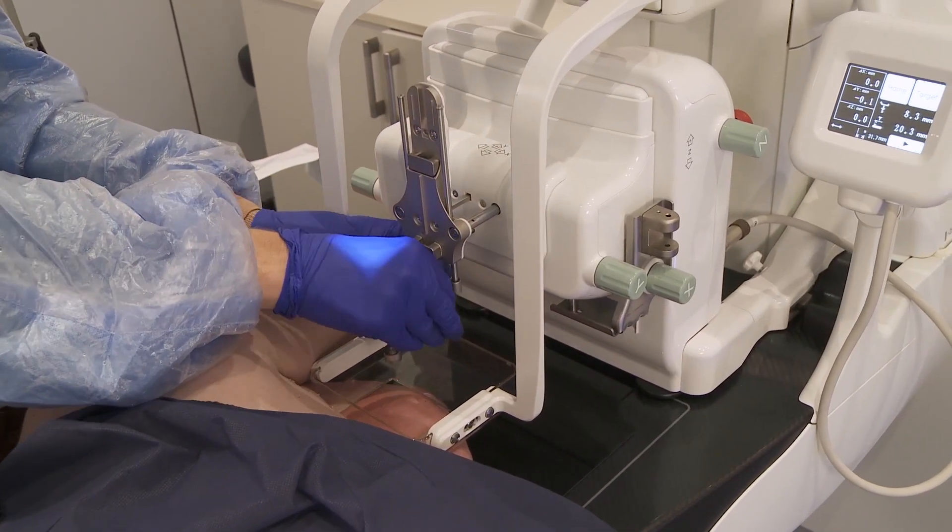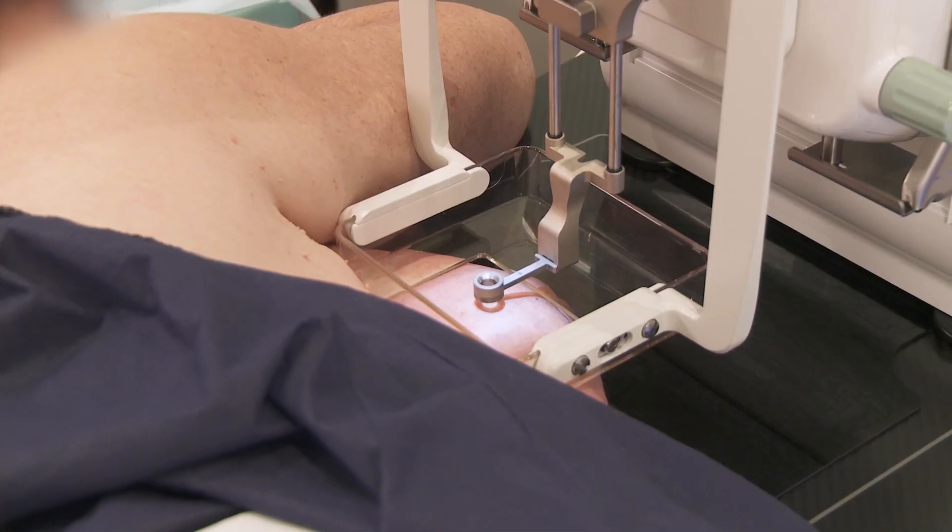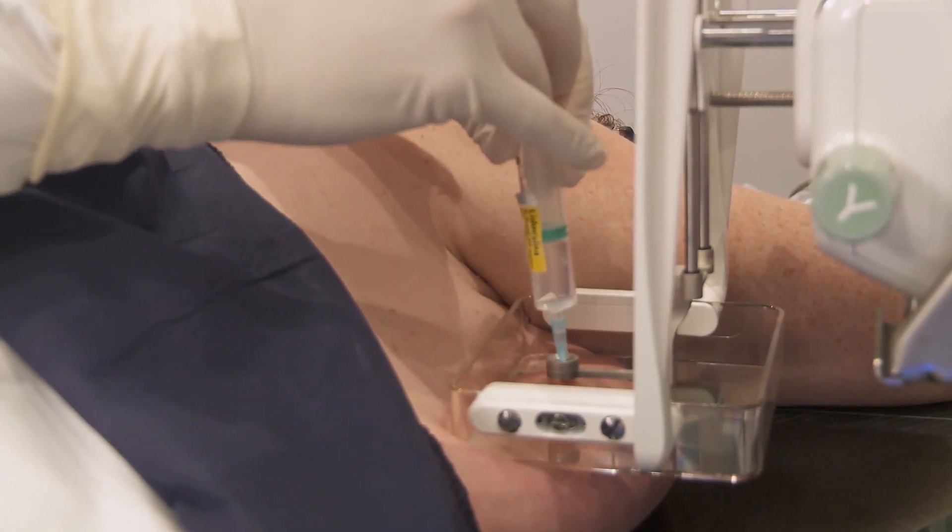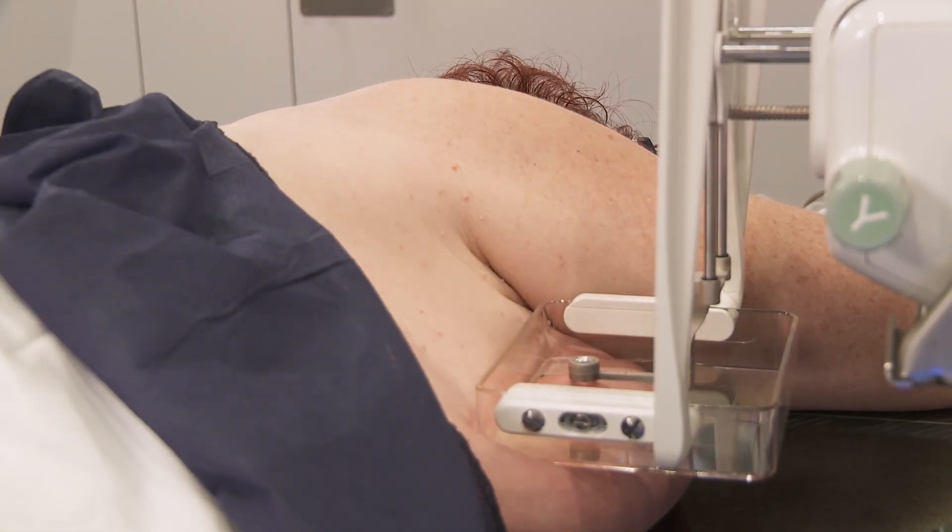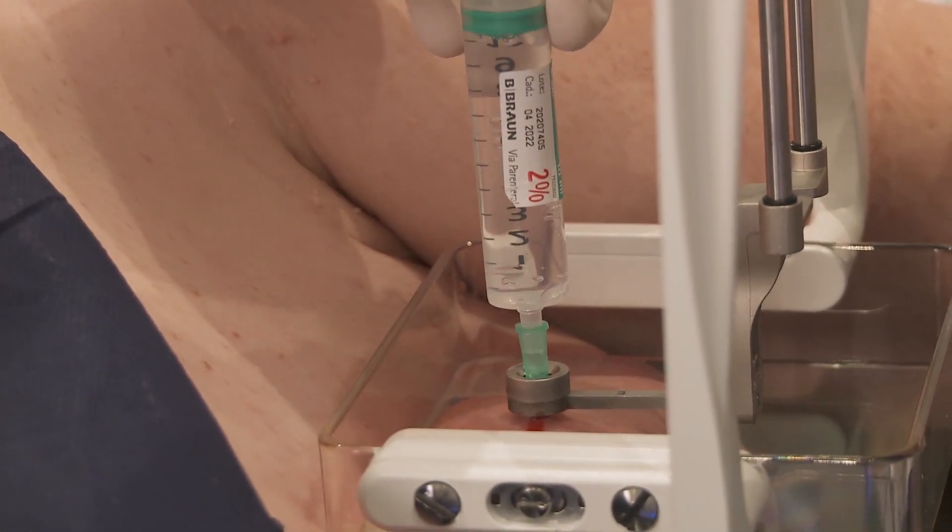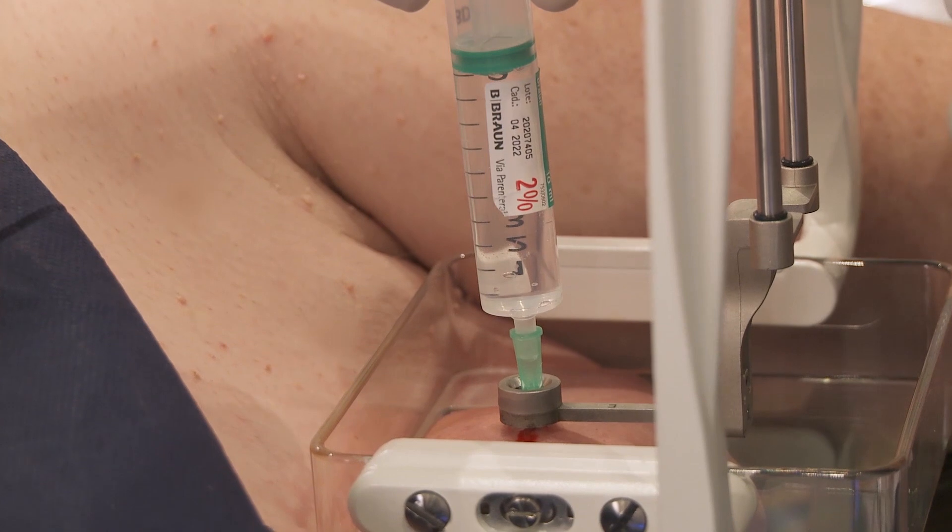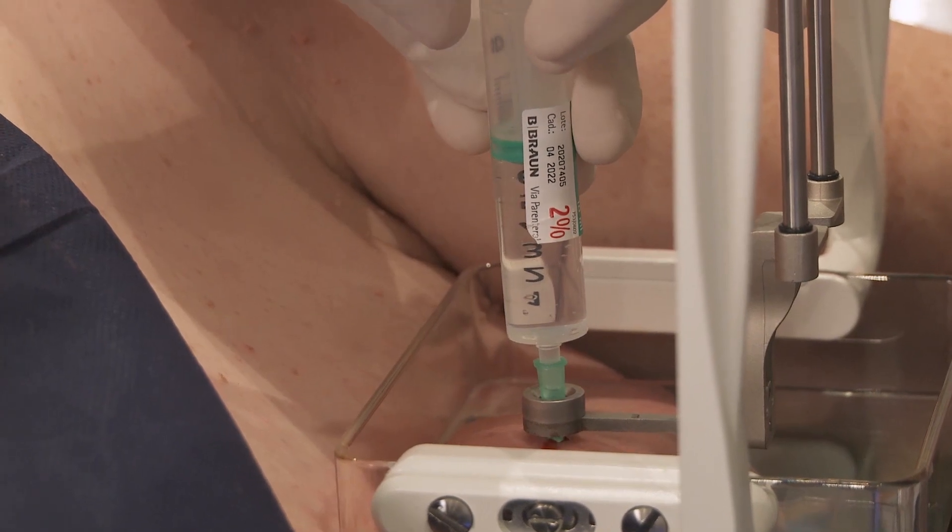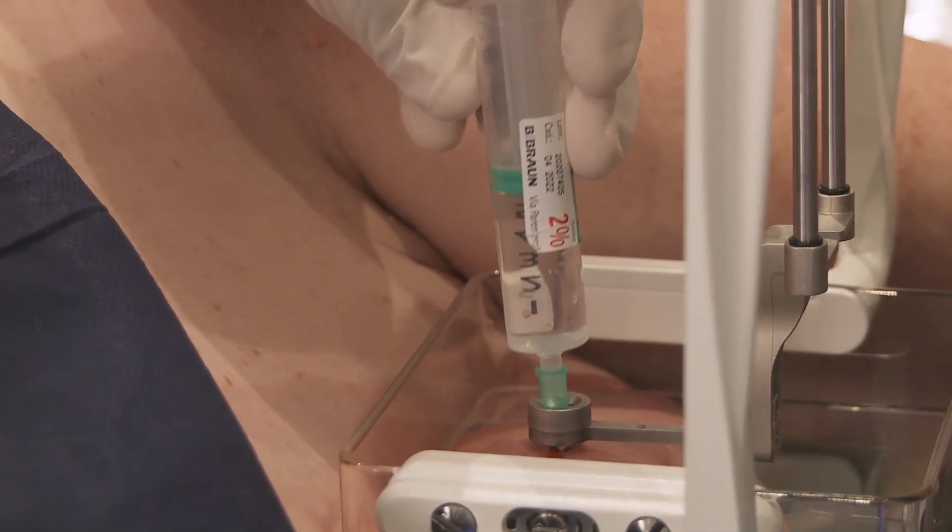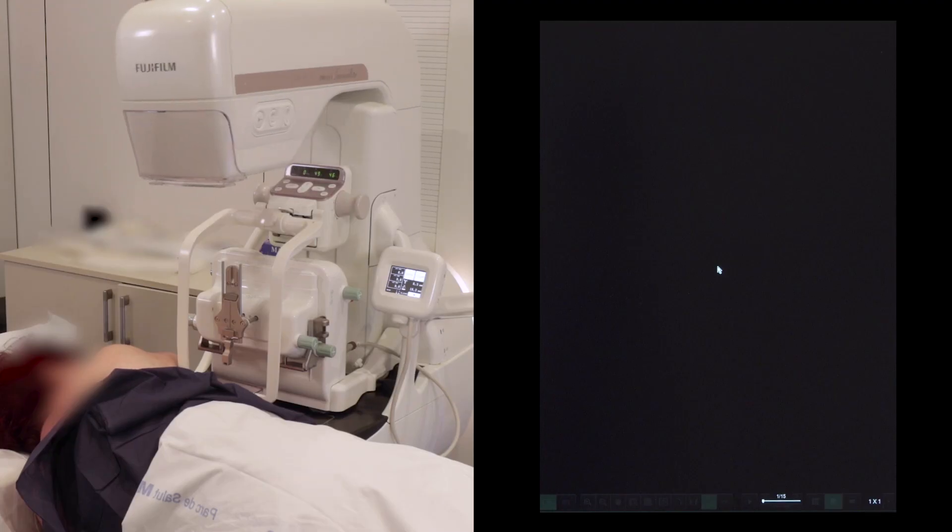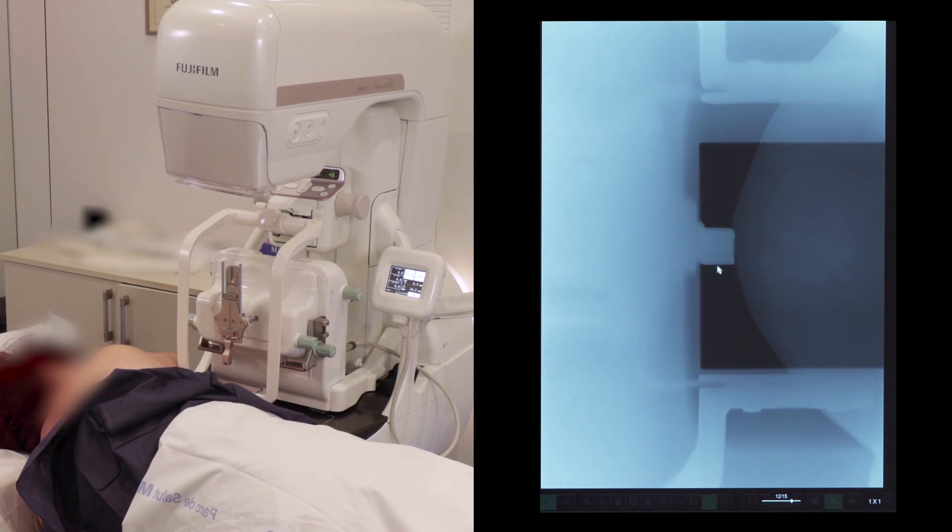Insert the Fuji needle guide holder and lower it down. Inject surface anesthesia to be followed by depth anesthesia. Press OK to confirm. Acquire a TOMO biopsy sequence for retargeting, since the target might have shifted. A new target is added due to the injection of anesthetic.